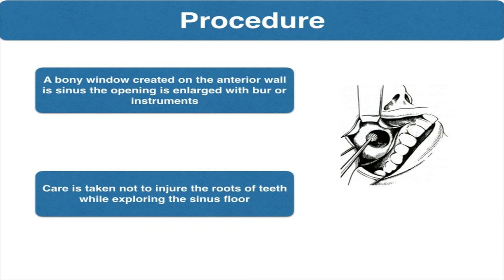A bony window is created using a burr or a rongeur and the window is enlarged with a burr. Care is taken not to injure the roots of teeth while exploring the sinus floor.